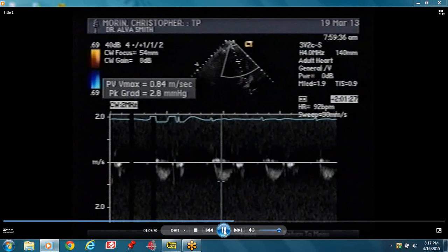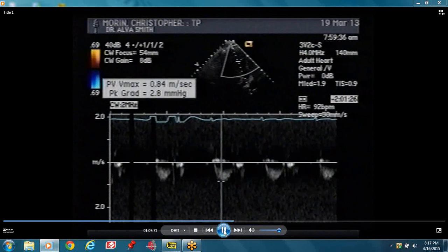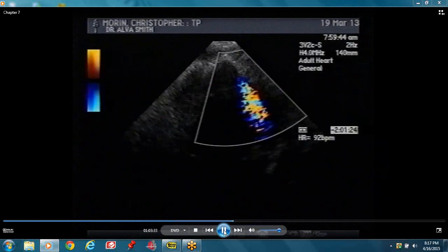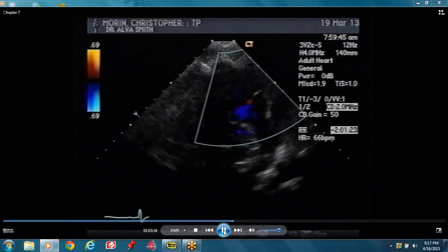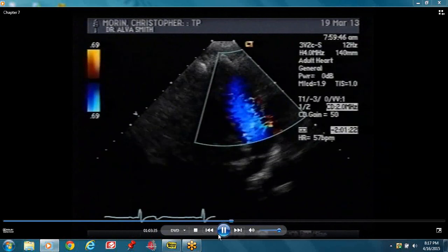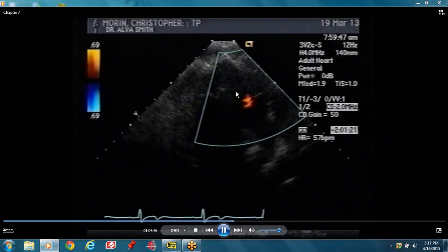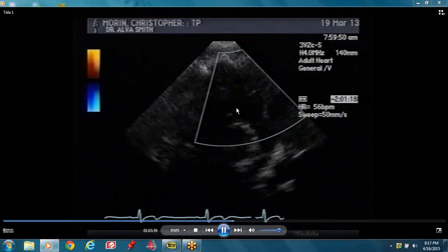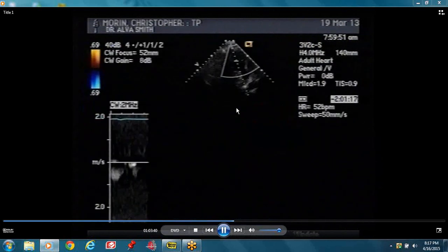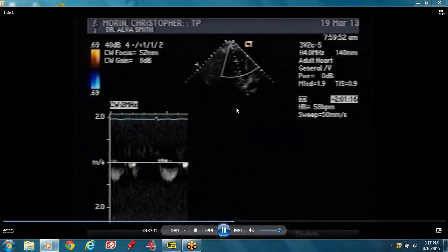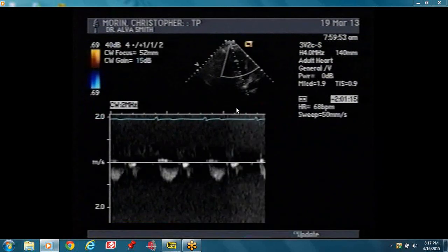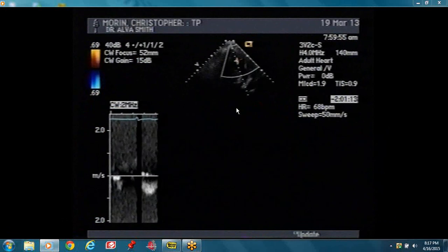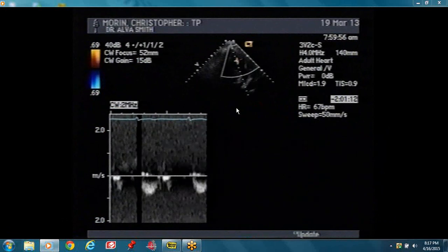You have to measure it and you should also plane it. You put your color across the valve to see if there's any pulmonary insufficiency or pulmonary regurgitation.